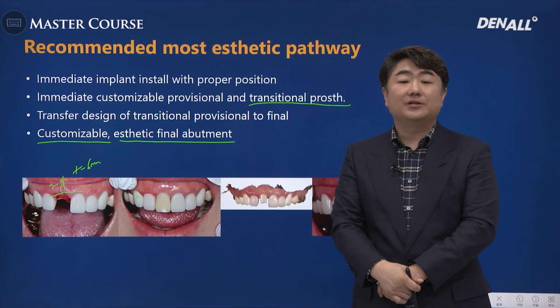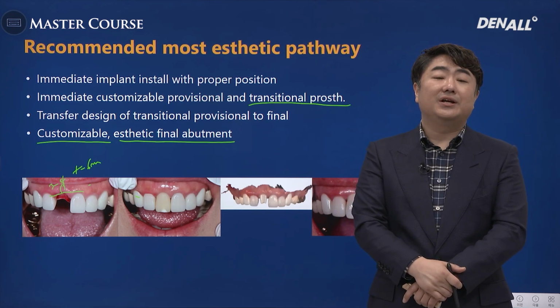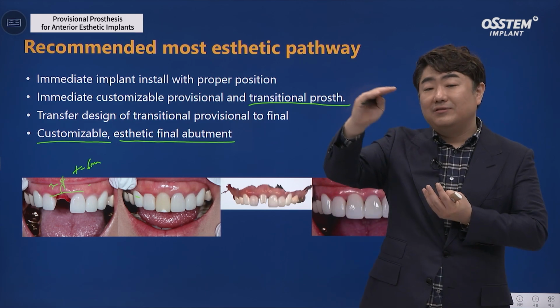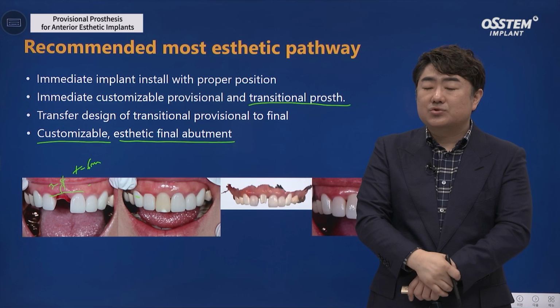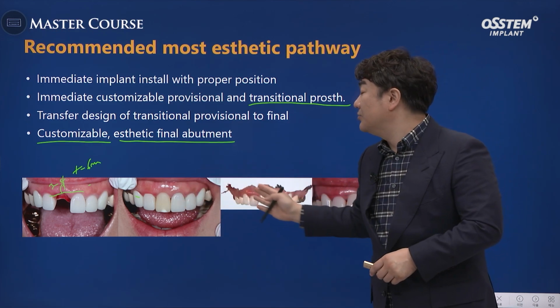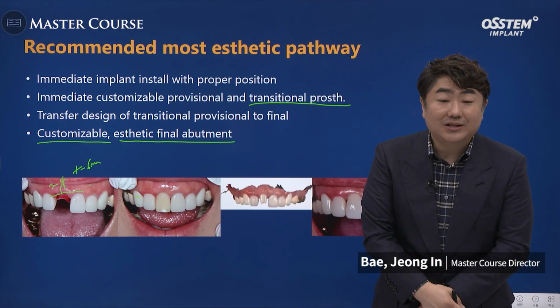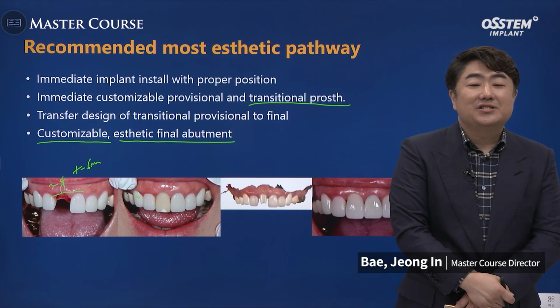The suprastructure should be monolithic multi-layered zirconia. I've recommended a zirconia with different transparency and strength in the cervical and incisal areas. For a single implant surrounded by natural teeth, which requires characterization and high aesthetics, porcelain veneer can be used.